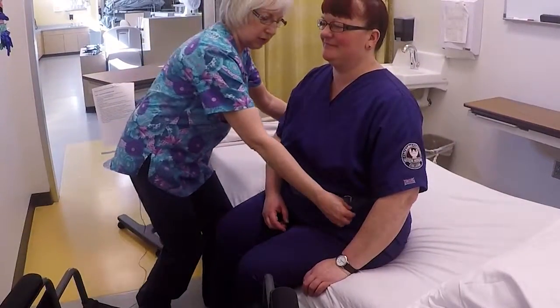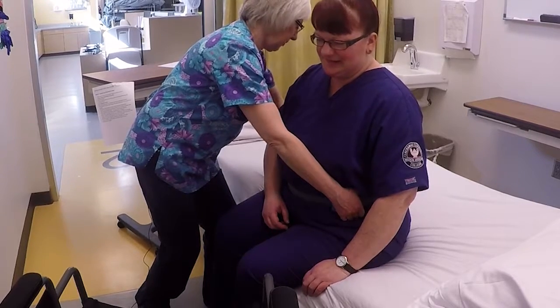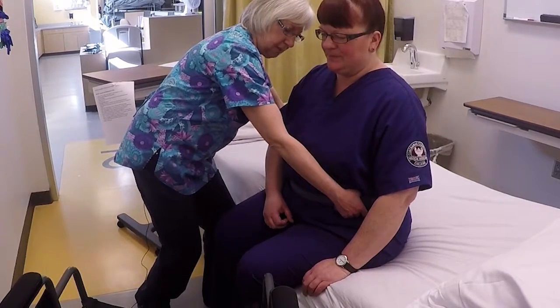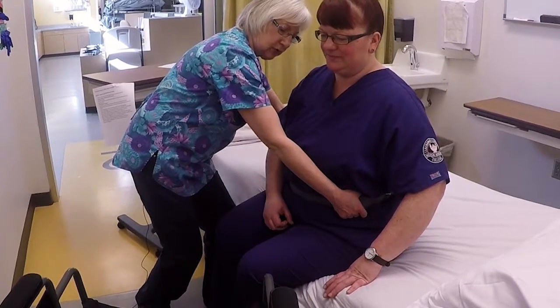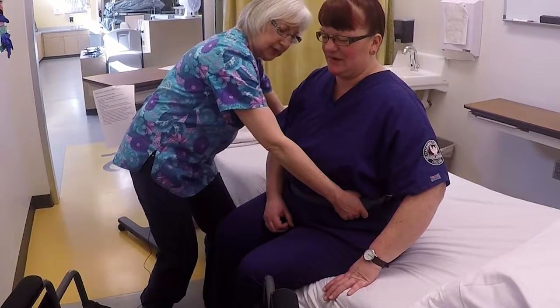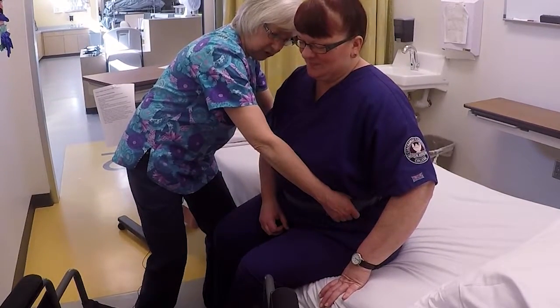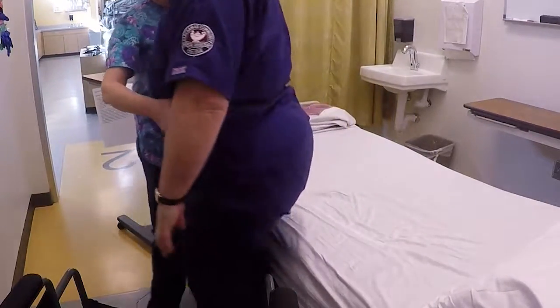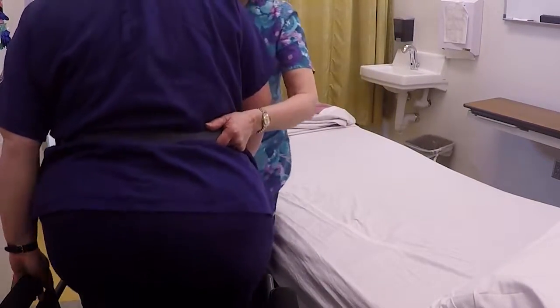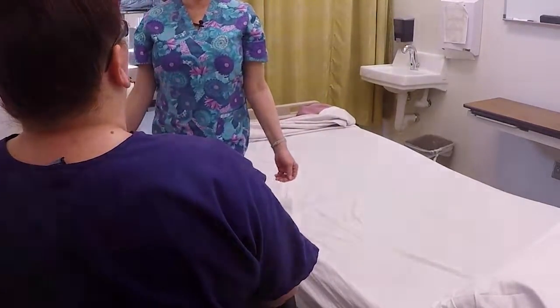Now I want to grab a hold of the transfer belt. I'm going to put my left hand on the outside of her weaker arm. I'm going to ask her to push off from the bed with her strong arm, and we're going to stand. I'm slightly looking toward the position we're going. Stand and pivot. 1, 2, 3. Stand and go down with her into the chair, keeping my back straight.